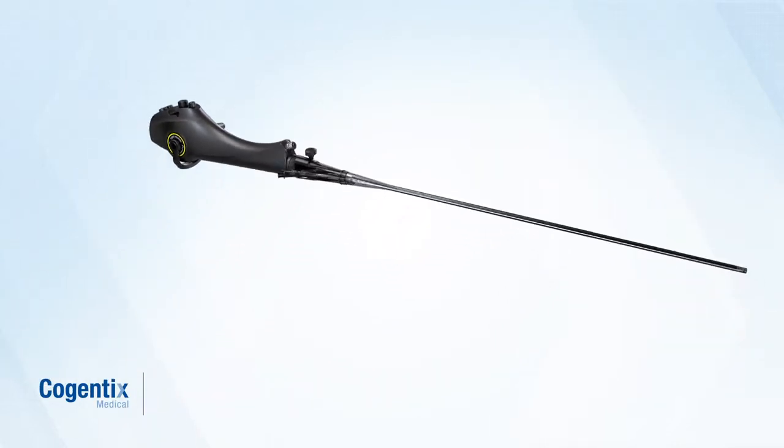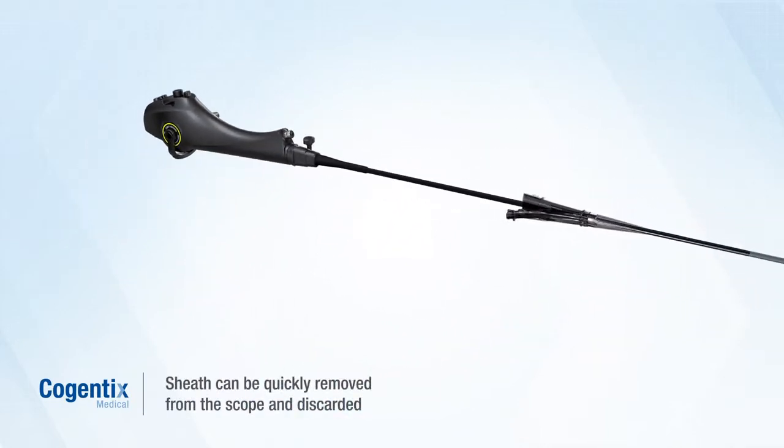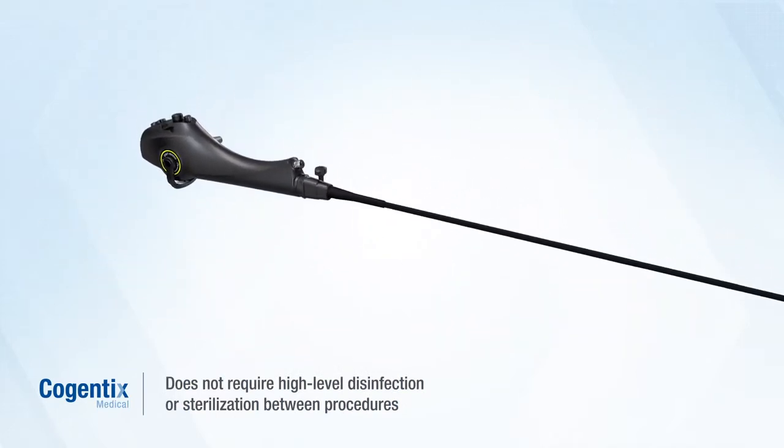After a cystoscopy procedure is finished, the sheath can be quickly removed from the scope and discarded following normal facility procedures. The scope is then cleaned and disinfected with an enzymatic and alcohol wipe.